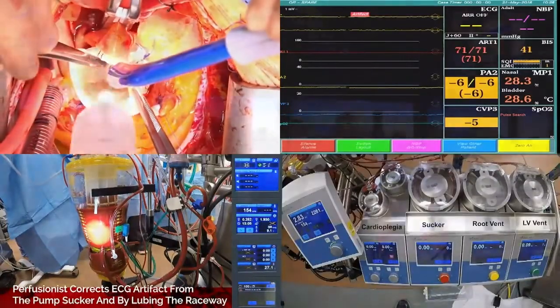So what do we want to do? Any discussion? Well, we can keep going, we can stop here if you want, and there's a couple more things and events to talk about. Let's talk about some more events. All right, go to your next one. There's Mike wiping the gel.